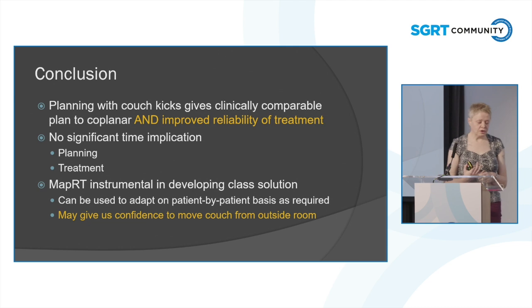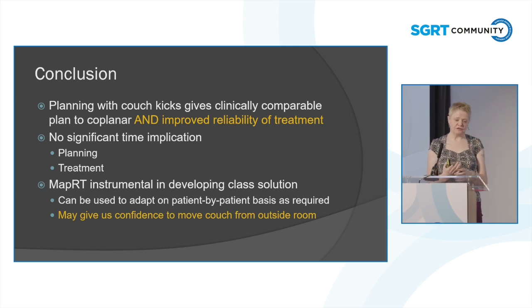So, conclusion. Planning with couch kicks, the most important thing, it gives improved reliability of treatment. Might not be the best plan, but the treatment is more reliable. And also, hope no one is going to quote me on this, otherwise I'll be shot, it might give us confidence to start to be able to move the couch from outside the room, because this is where MapRT has come in. It was instrumental in developing the class solution.